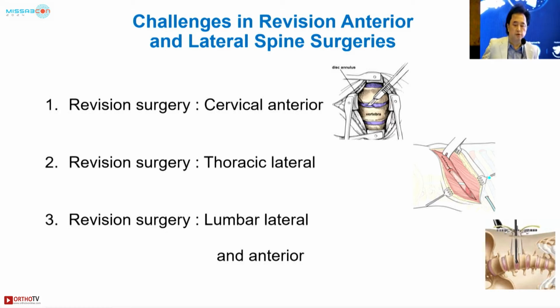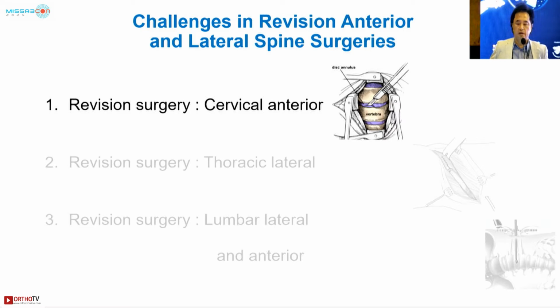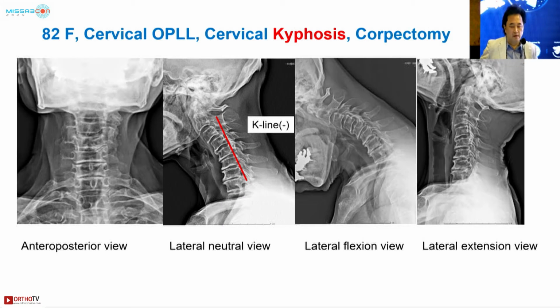This is my talk today. First, I'd like to mention anterior revision surgery. This is an 82-year-old female. In Japan, we are now suffering from the graying of society. We have a lot of elderly patients. If you look at the lateral X-ray, the OPLL is K-line minus. This means a candidate for anterior approach.